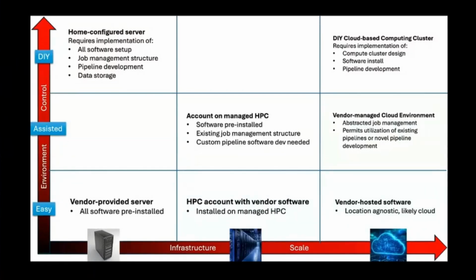Some of them even offer graphical user interfaces where you can pick a software and a file and draw arrows and build a pipeline that way. Illumina in particular has an entire DRAGEN pipeline that will work on next-gen oncology panels, and it'll perform the bulk of the analyses quite well just out of the box. And you also have the option to modify it or add modules to it. So these are some of the newer frameworks that probably make the most sense for a lab that's just starting out, particularly if you don't have a huge amount of in-house bioinformatics support.